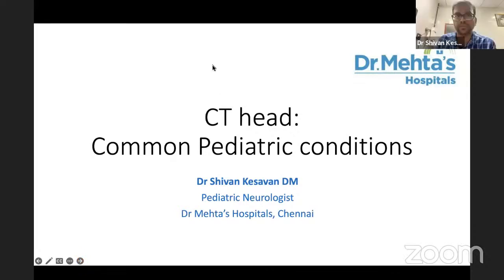So today my part is going to be on the common pediatric conditions which we encounter in day-to-day practice and the utility of CT head in that.